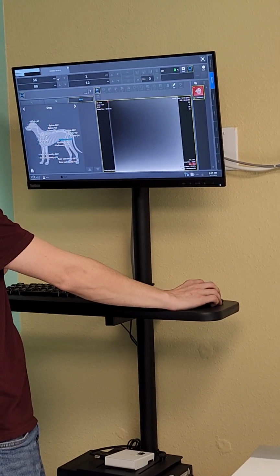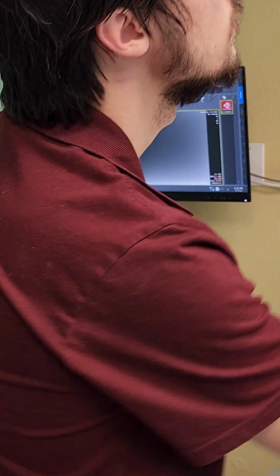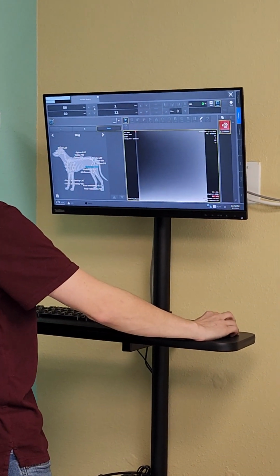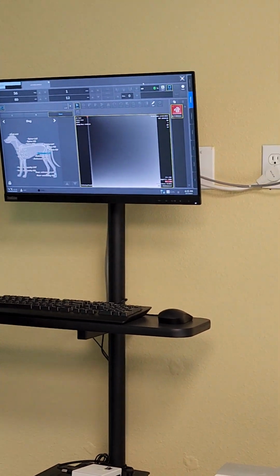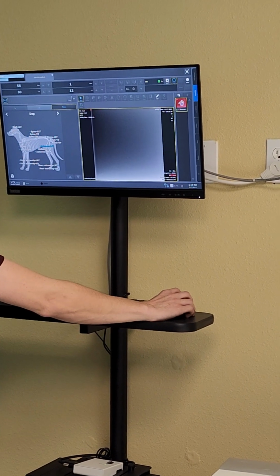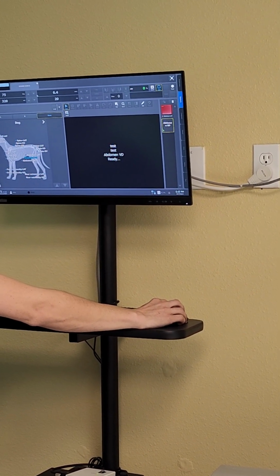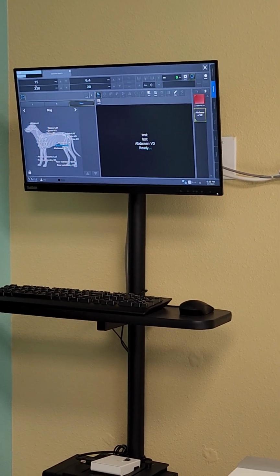And you can also adjust some of the settings up here, I believe. Maybe not, I might be wrong. Since you already rejected it, maybe it doesn't let you. I don't know. Maybe you're right. Let's open a new image. Okay, that's fine.